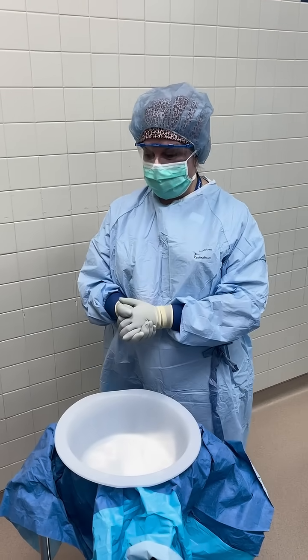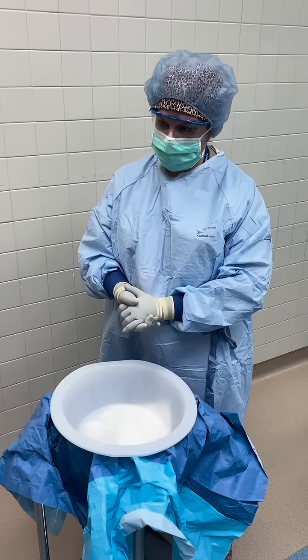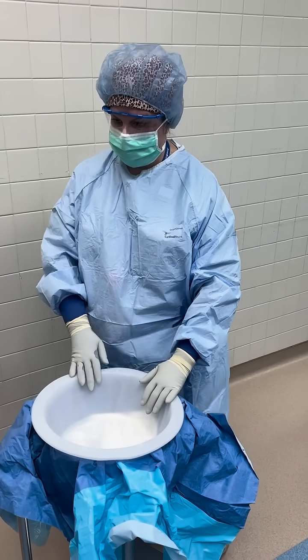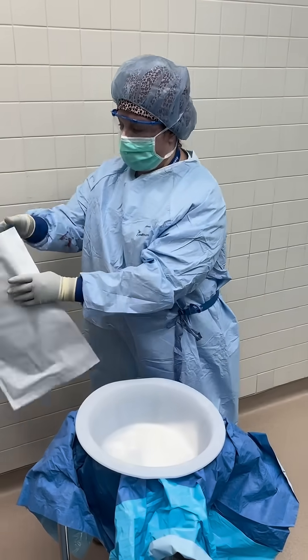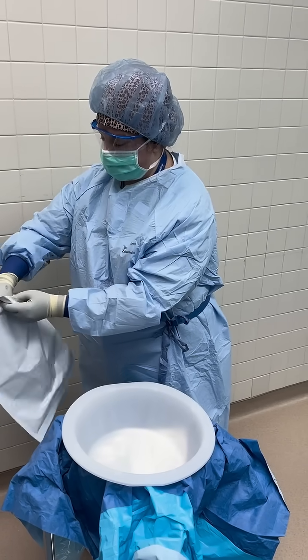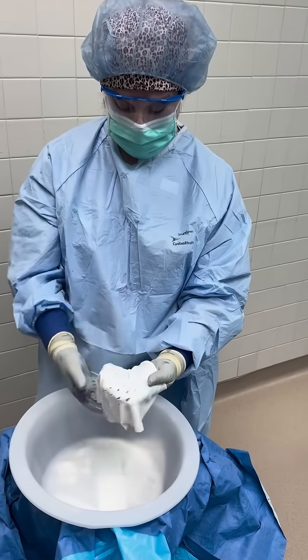I'm going to show a little video as to how I prepare the Flex HD. First I change my gloves and then I'll have the nurse open up the package for me. I personally am going to be the one to handle the package and remove it. This is what the implant looks like — it's not sided.